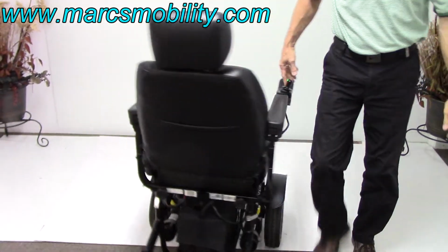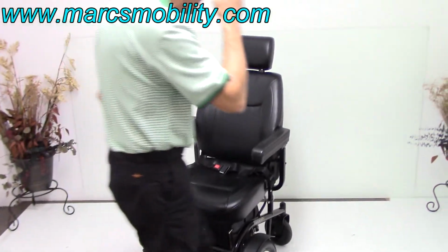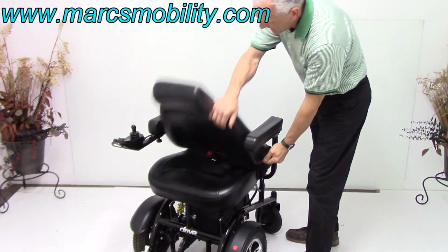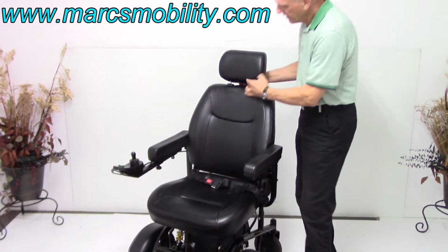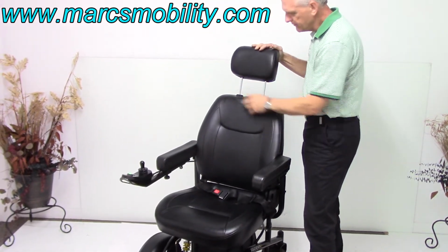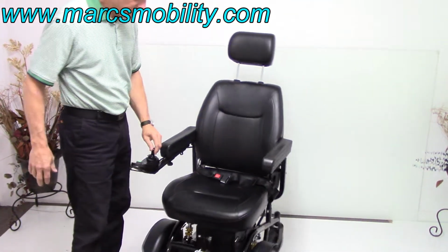This is an adjustable seat. What that means is it's a captain adjustable seat. Right here's a lever, and the seat can be folded back down or all the way back to here, depending where you want it. And you have an adjustable headrest right here. You can adjust the headrest any position you want. So this is a pretty simple power chair.